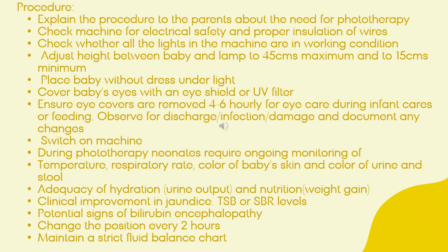Ensure eye covers are removed at a 4 to 6 hour gap for eye care and for feeding. Then observe the eyes for any discharges, any infection signs, damage to the retina, and document the observations. Again, switch on the machine.